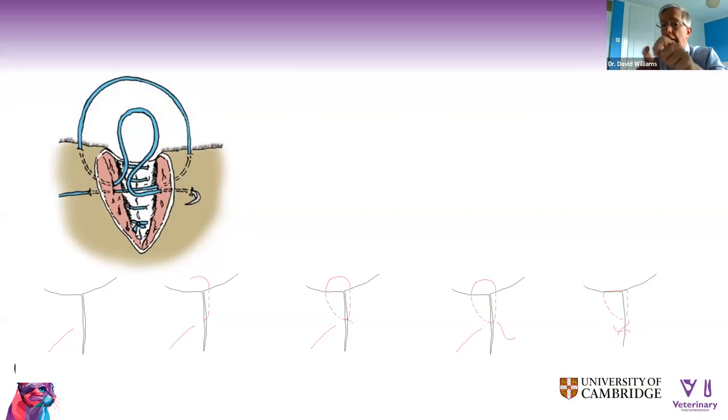And if you tie it all together and there is a step in it, take it out and try again, because the last thing you want is to do a really nice excision of a tumor and end up with a corneal ulcer because you've got this little step in the edge. So that's just a little tip.